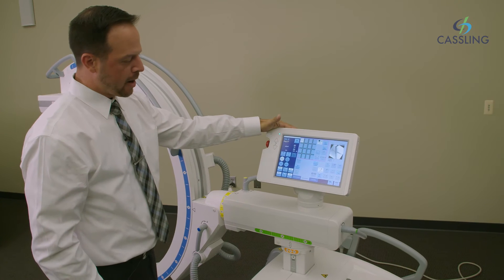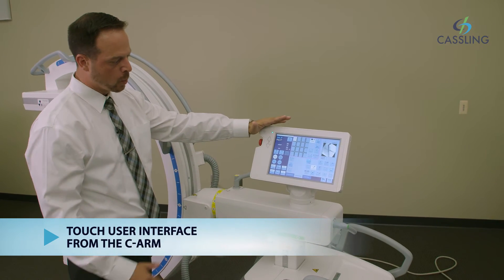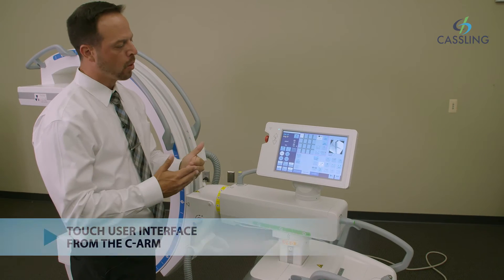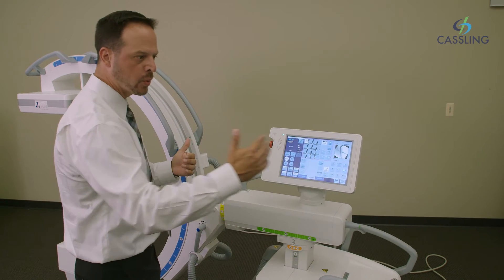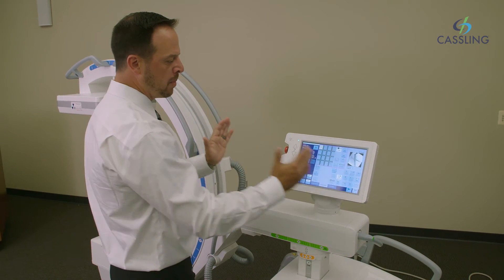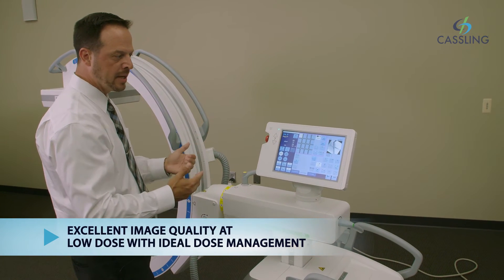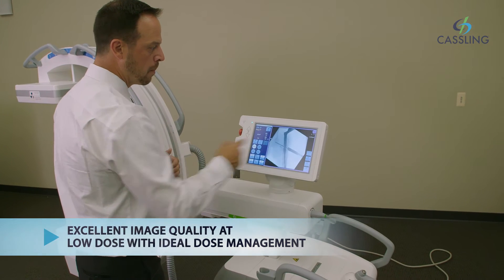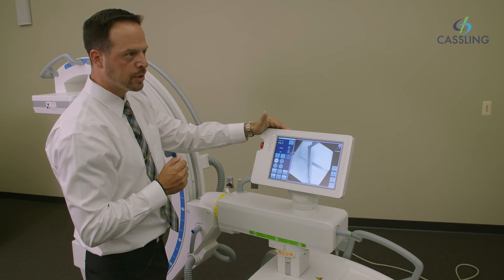This is our control panel, which gives us full access to the C-Arm during the procedure. It helps speed up the workflow of the procedure, as well as eliminating the tech having to go back and forth between the monitor cart and the C-Arm. We have all the abilities here to post-process and prep all the images that are taking place during the procedure. With just one touch of a button, you actually get a field of view of what you are exposing at the patient, so you do not have to go over to the monitor cart to see what you're exposing.